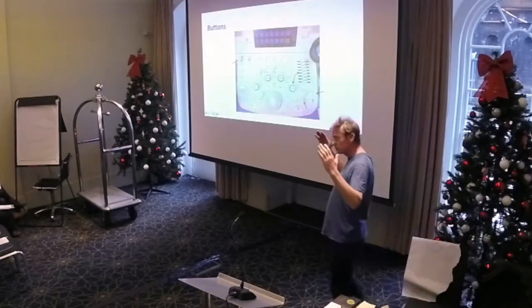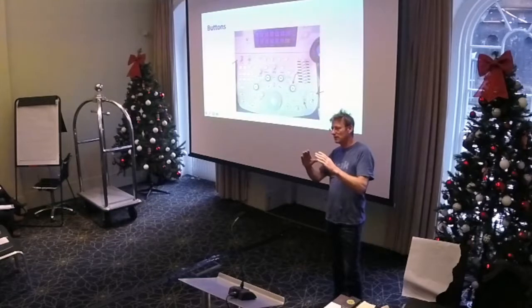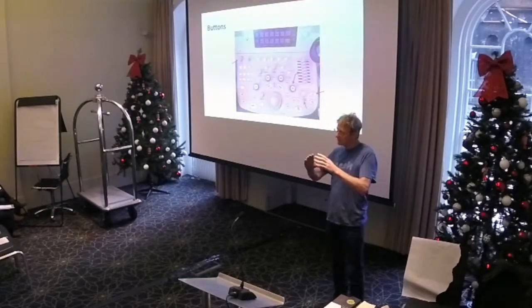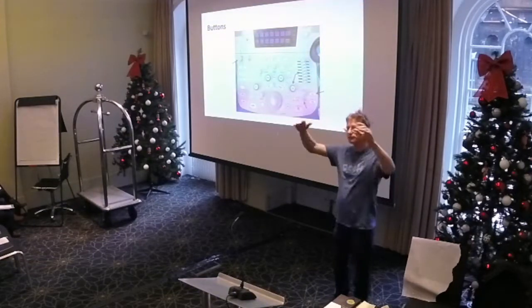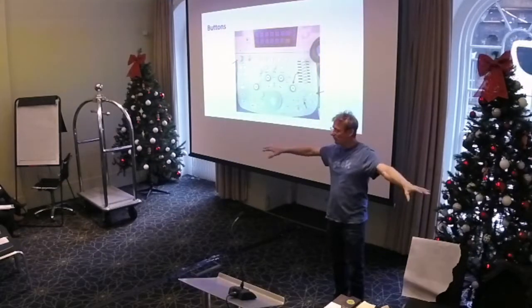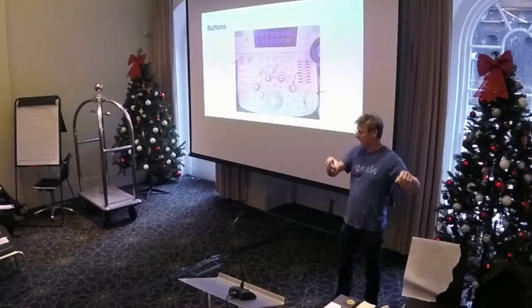The most important thing, though, is these two. Zoom. If you zoom in, what you should do is only have the computer in the machine thinking about what you're looking at. Because what happens is you scan, you go, oh right, I'm now looking at a heart, and yet you've got all this other image that that poor computer is having to analyse. It's doing all this work.